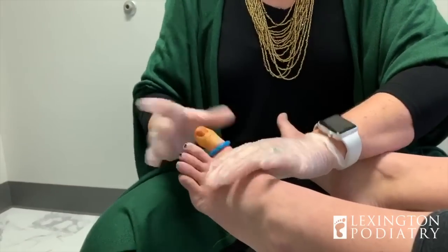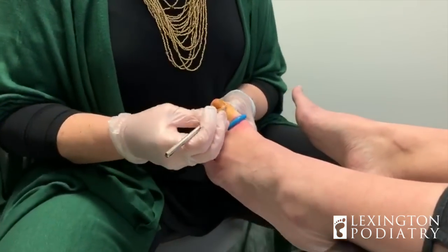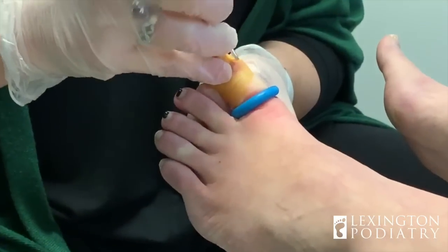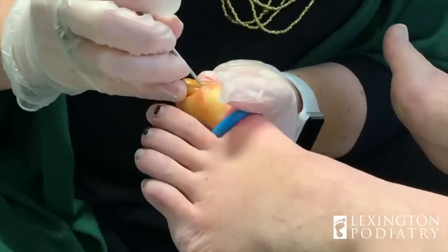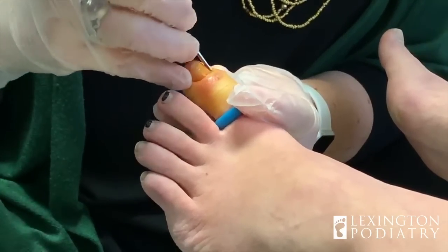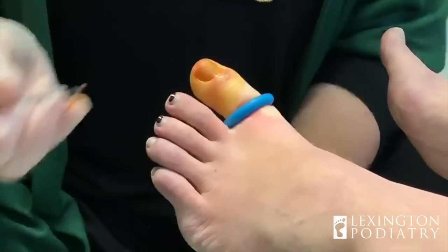And that is the tourniquet — it's just like a big rubber band. So this is a sharp tool, we're going to see if you can feel it, anything there or here. Nope. Okay. When I poke, you just let me know if you feel anything sharp. Are you good, Amber? Mmhmm. So we loosen the soft tissue up from the base of the toenail, up the sides.